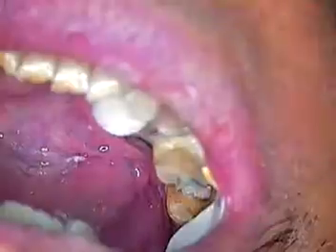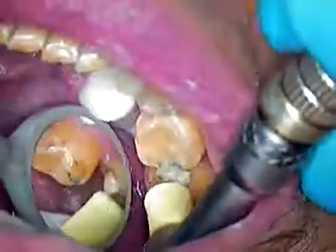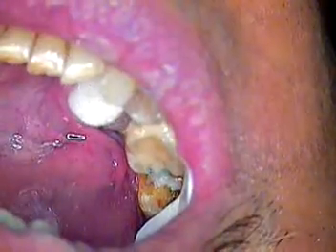This disc works really well on the distal of the adjacent tooth. And then the final thing is to go around with a yellow cup to polish the prep itself.